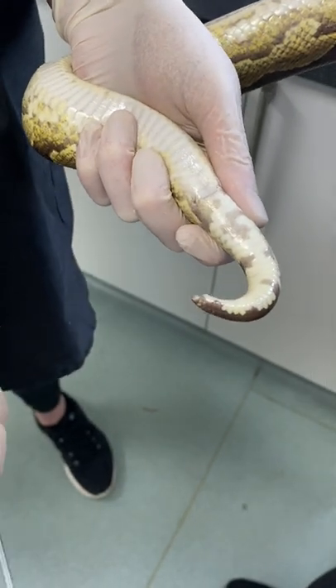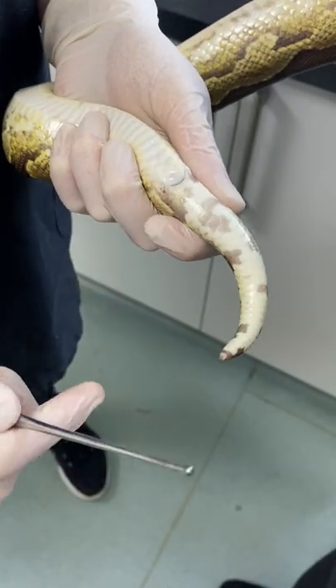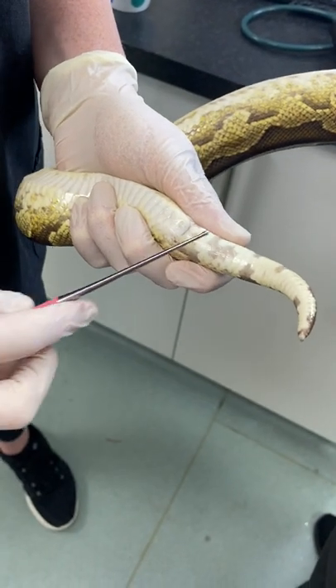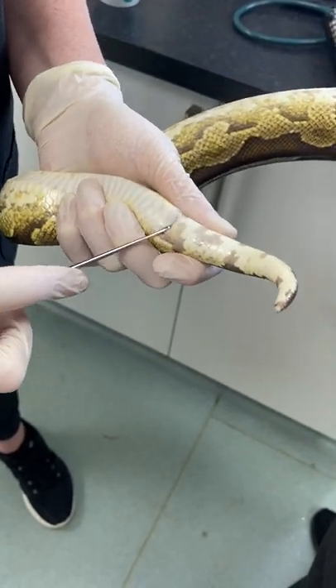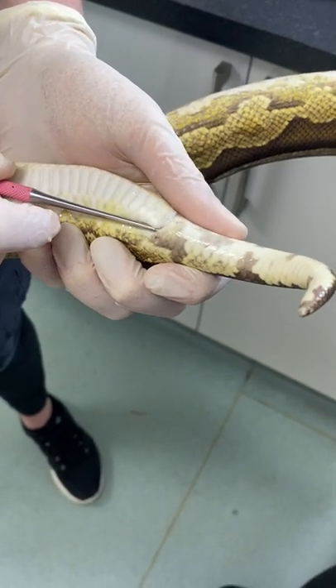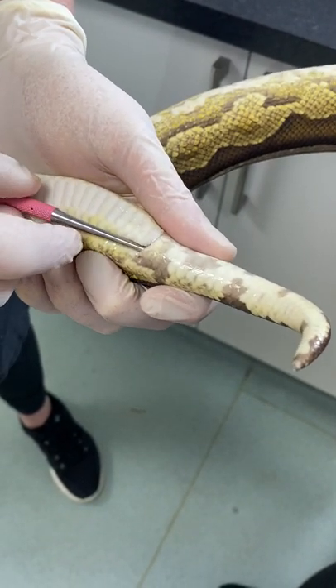Today we're going to be showing you how to sex a snake. First, we want to make sure that our snake is appropriately restrained — I normally have the tail facing away from me, with the head at the opposite end. We want to pop a little bit of lubricating gel around the cloaca, place the probe in, and then face it back down towards the tip of the tail.